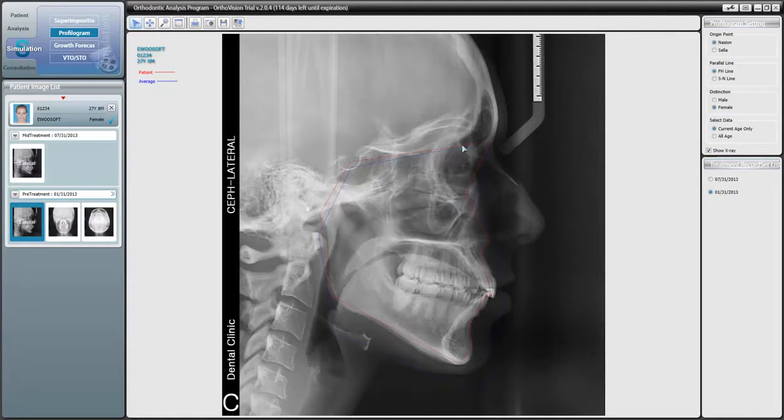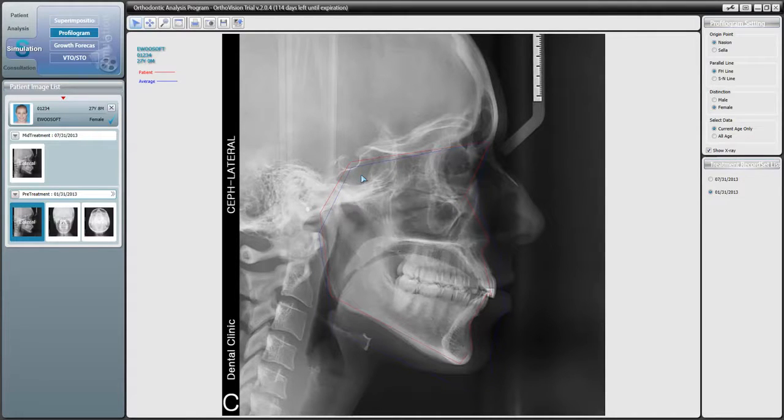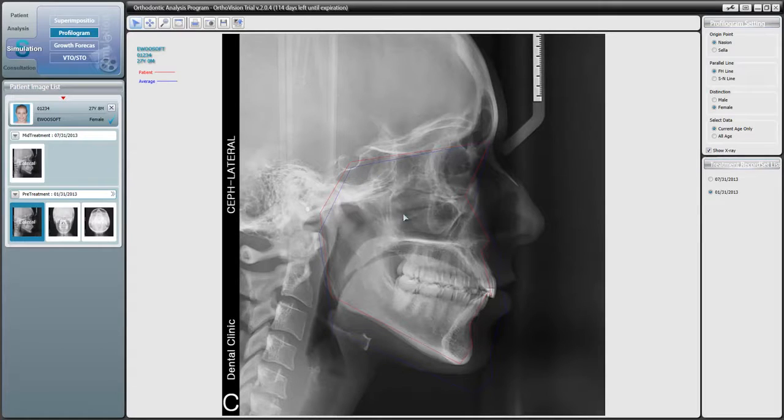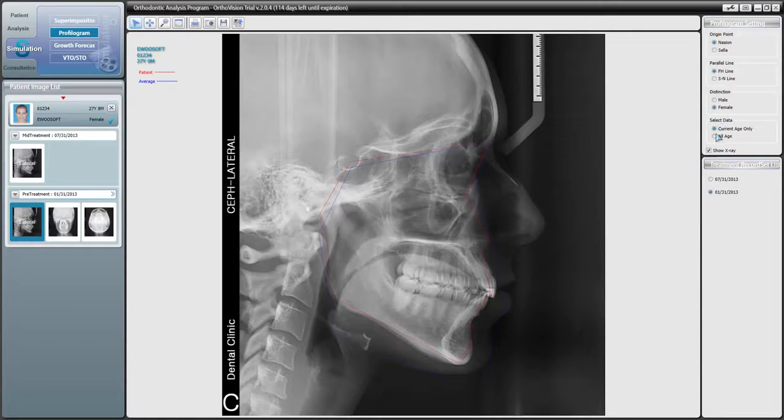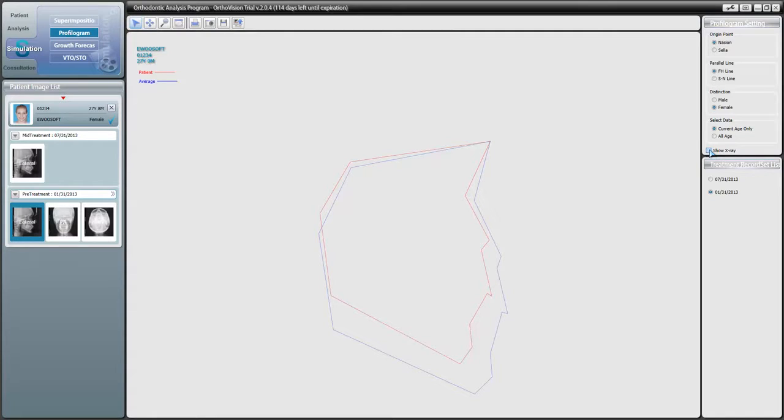Here we see our profilogram overlaid over our x-ray. Our patient's profilogram is marked in red while the average profilogram is marked in blue. We can toggle our x-ray on and off by simply clicking on the checkbox at the bottom of the upper right menu. I'll leave the x-ray off for now in this video to clearly show our profilograms.